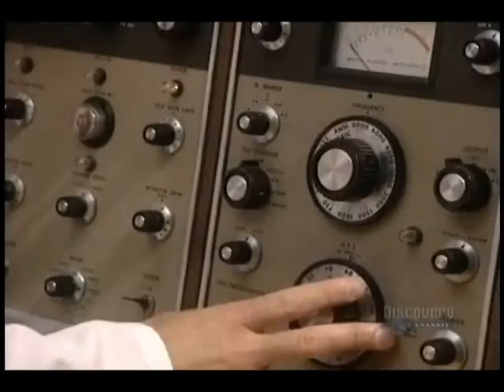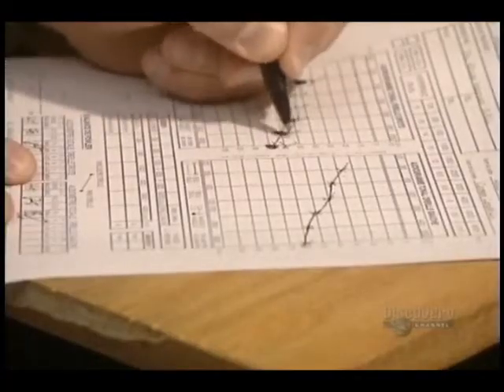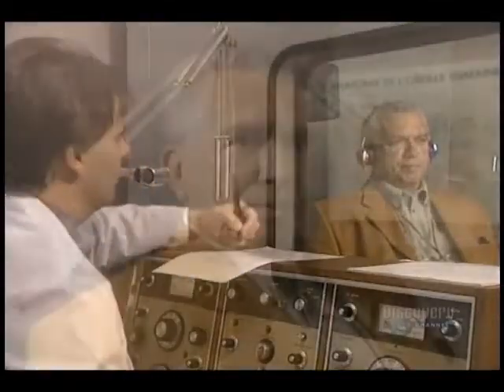It's easy to take sound for granted until you lose it due to a serious hearing disorder. Thankfully, this tiny hearing aid brings back the music. Loss of hearing causes a serious handicap, but happily it can be remedied thanks to hearing aids. But before fabricating the aid, the degree of hearing loss must be precisely measured with this apparatus called an audiometer.